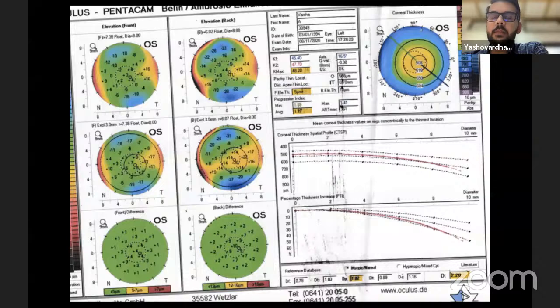So BAD. I'll be talking about the left side first, which is depicting the elevation front, diameter maintained at 8 diameter here, and the central portion is showing +3 elevation. This is the raw data, and then we go to the best fit sphere model, and here the elevation is about +7, and at the thinnest local point it is actually +8.